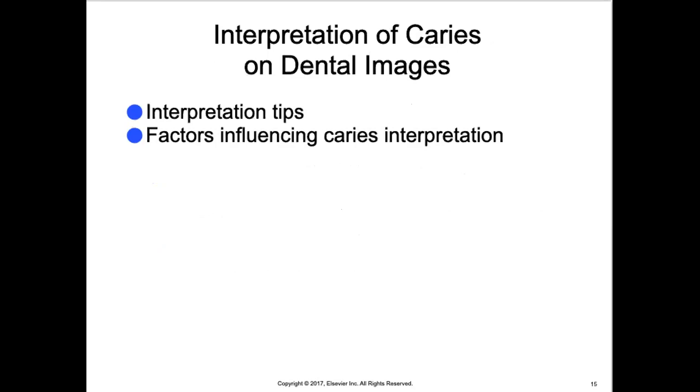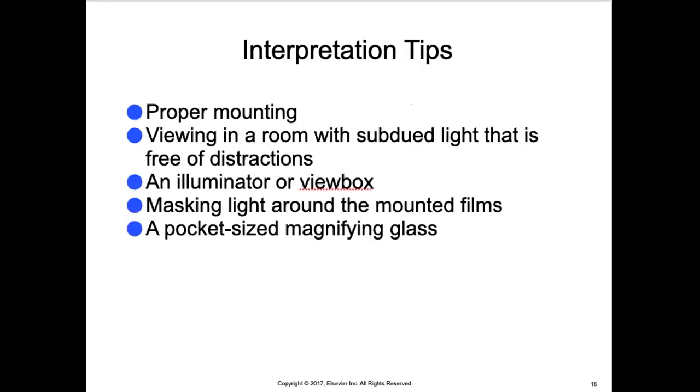So the dental radiographer must be confident in the use of interpretation methods and must be able to identify factors that influence the radiographic interpretation of caries. Dental images should always be viewed in the presence of the patient.